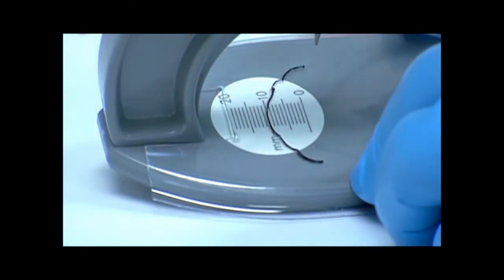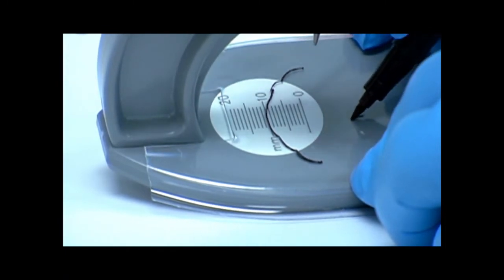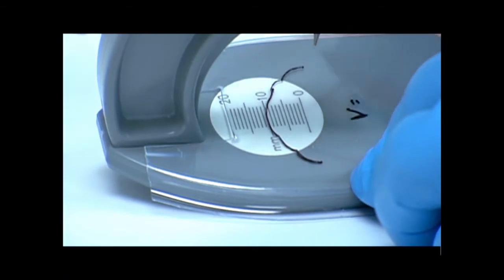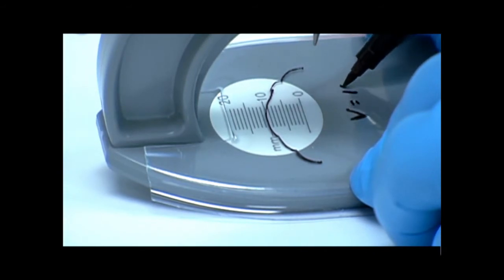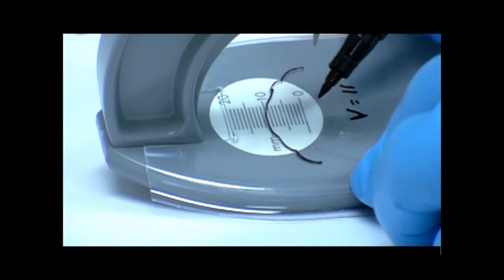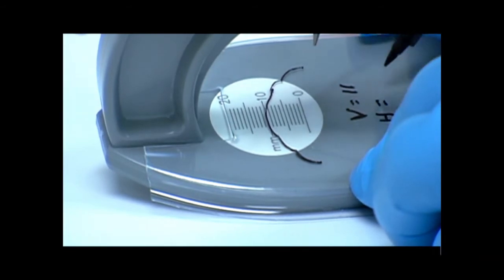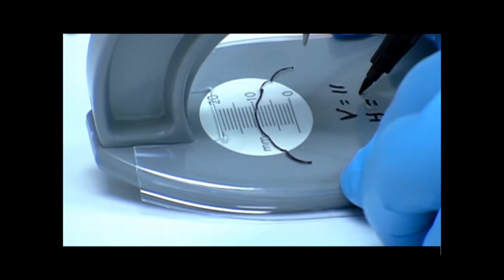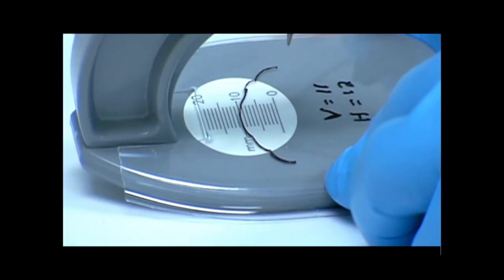So to complete our prescription to the laboratory, as I mentioned, our vertical measurement, the first measurement with the plunger up here, we measured at 8 millimeters. However, we're going to add 3 millimeters because I think the patient could use that extra incisal length. So to the laboratory, our prescription is going to be 11 millimeters for that vertical measurement. Horizontally, we measure at 10 millimeters as we see from the patient's existing denture, but my horizontal suggestion to the laboratory is to add 2 millimeters to that to make that perhaps a 12 millimeter forward position of the wax rim in this particular case.